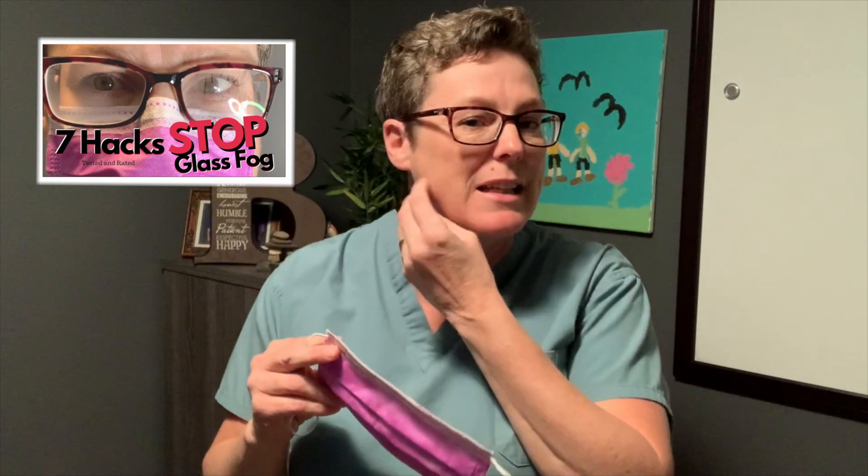One of the biggest concerns with a surgical mask, as we saw in the seven hacks, is the pouching that we like to have in order to get the air out so that we don't fog up our glasses. While that's great for reducing glasses fog, it does leave us at some risk with the infection control component. Doing a little bit more research, I found this hack that I want to share with you today.